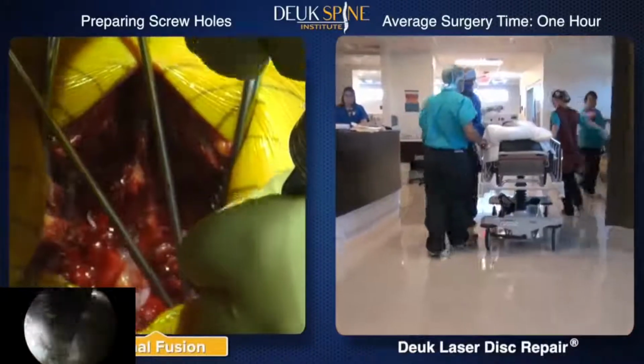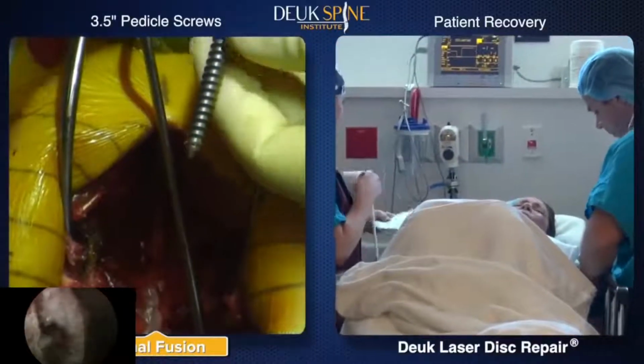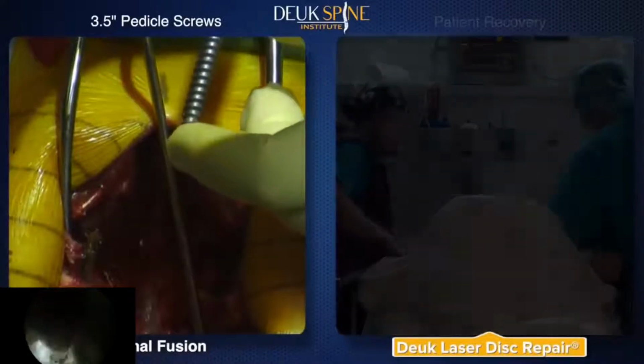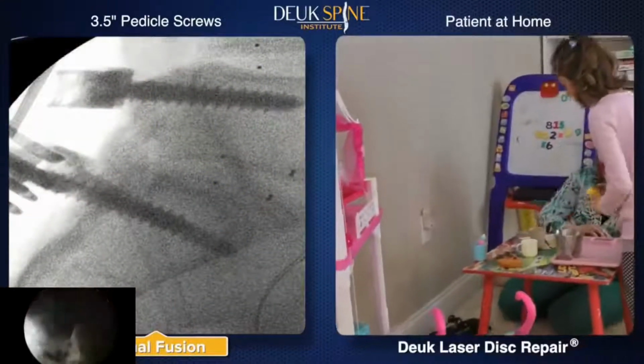The fusion, however, is still underway. Holes in the spine must be tapped in preparation for the large pedicle screws that anchor the fusion hardware. The Deuk laser disc repair patient is in recovery usually 45 to 60 minutes before release to go home. The fusion screws are inserted into the bone, as shown in the X-ray.